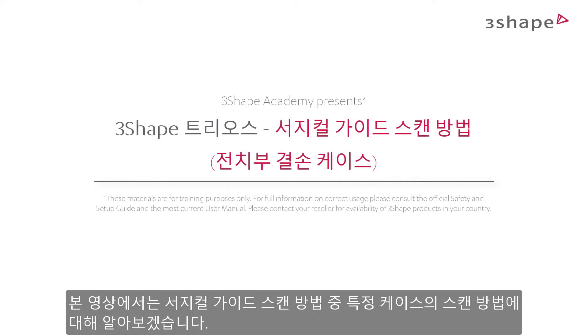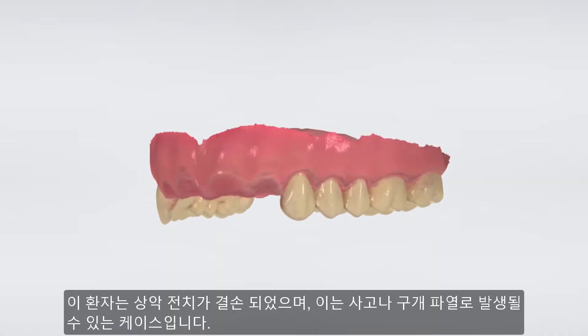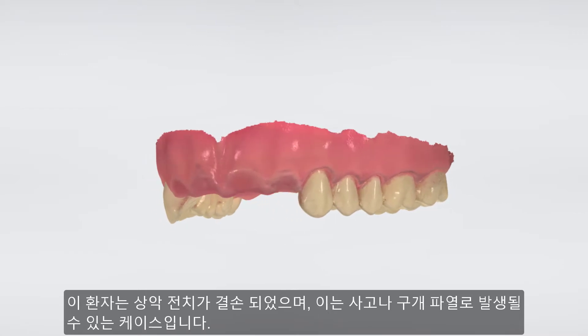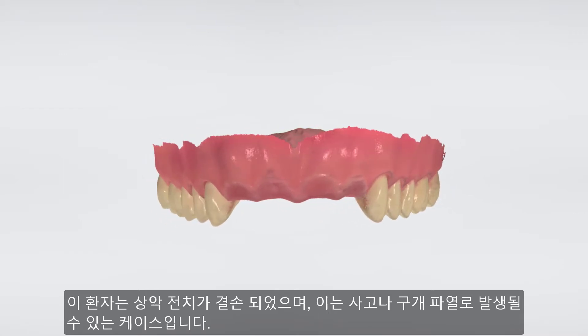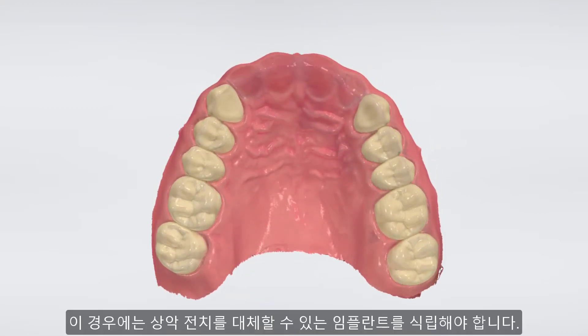Welcome to this How to Scan for Surgical Guide series, where we will explain how to scan for a particular case. In this case, the patient is missing the front teeth in the upper jaw. The reason could be an accident or because of a palatal cleft. In this case, we want to replace the front teeth with implants.